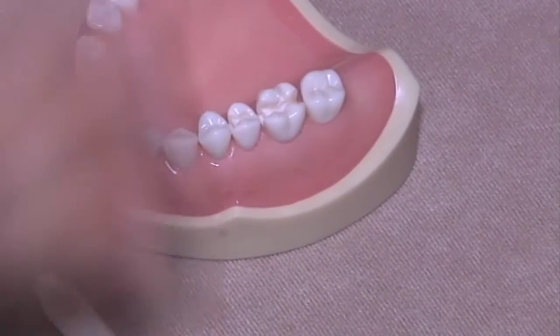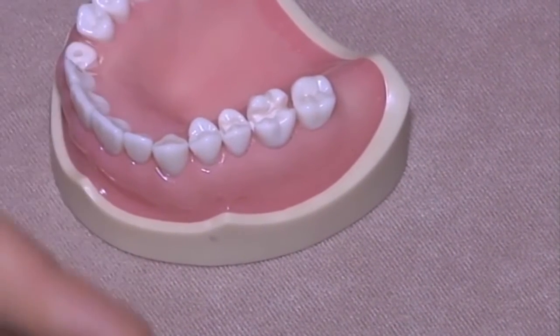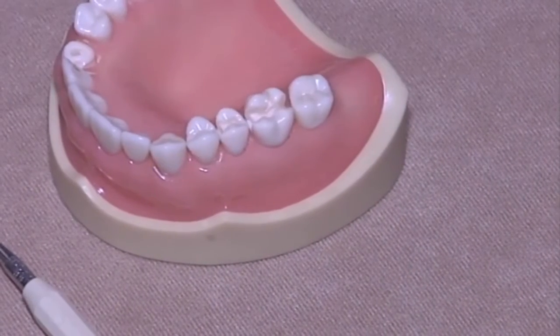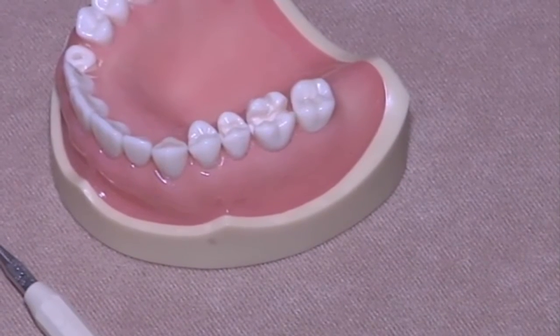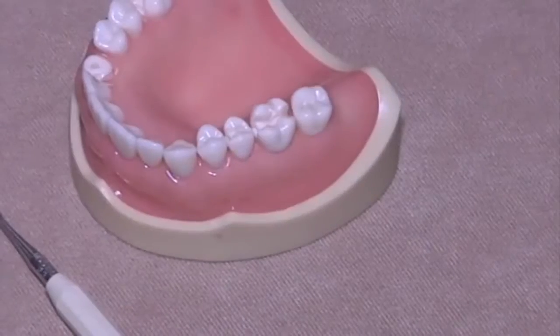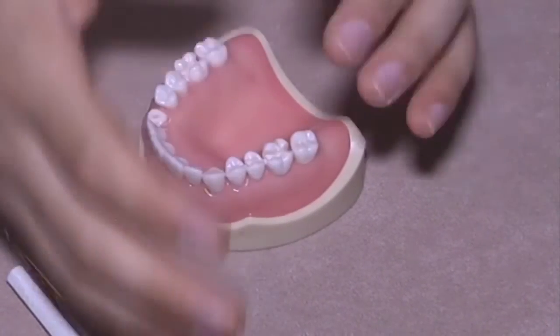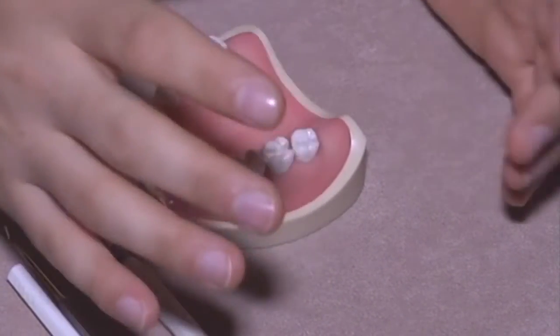Contraction stress is lower, and the most difficult part of the restoration, you do it immediately, and then you can think in a positive way during the whole restoration. And then you can manage also the anatomy of the tooth in a proper way.